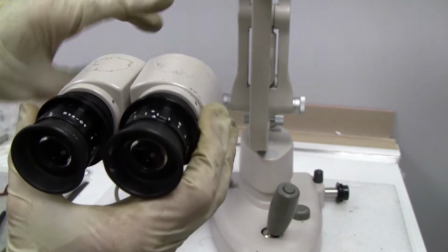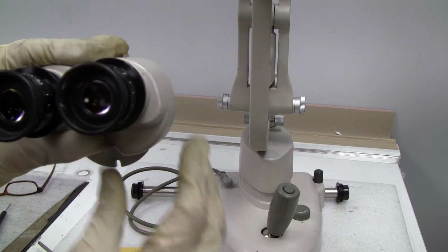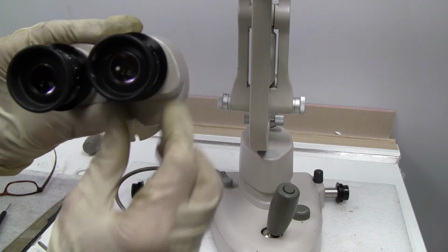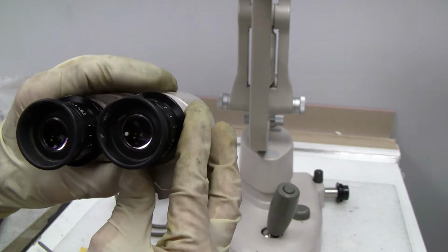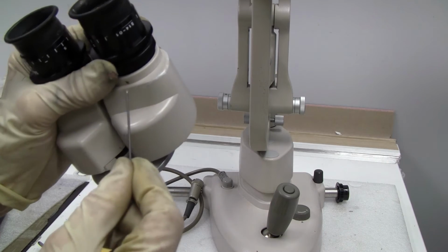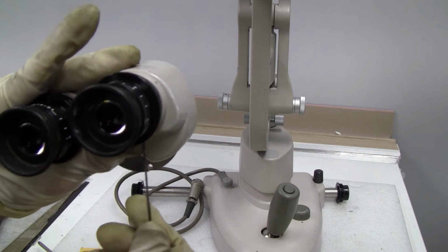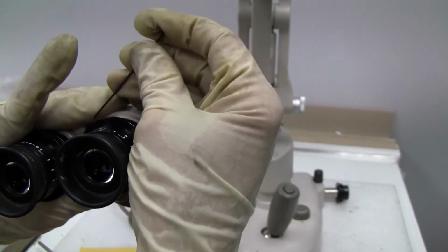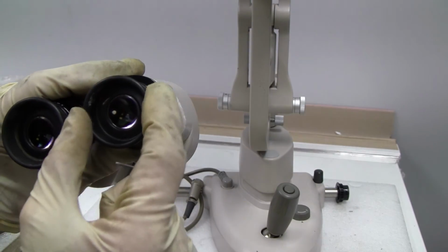And then you would look through your eyepiece with your light on and watch which way it needs to move to get your light back in the center to match the other eye. So you would move it one way or the other and then hold it with your finger, get your Allen, and begin to tighten your screws. Tighten it gently until it moves out of the way, and then stop. Back it up a little bit and then tighten all 3 of them while you're looking through your eyepiece, keeping the light centered.